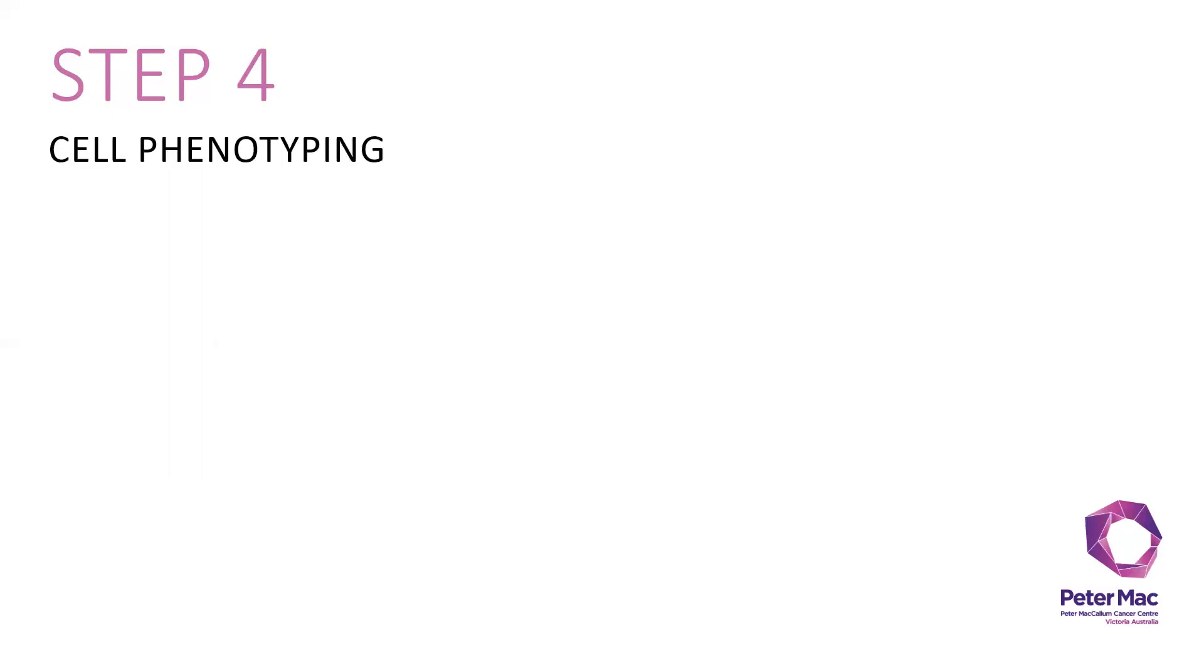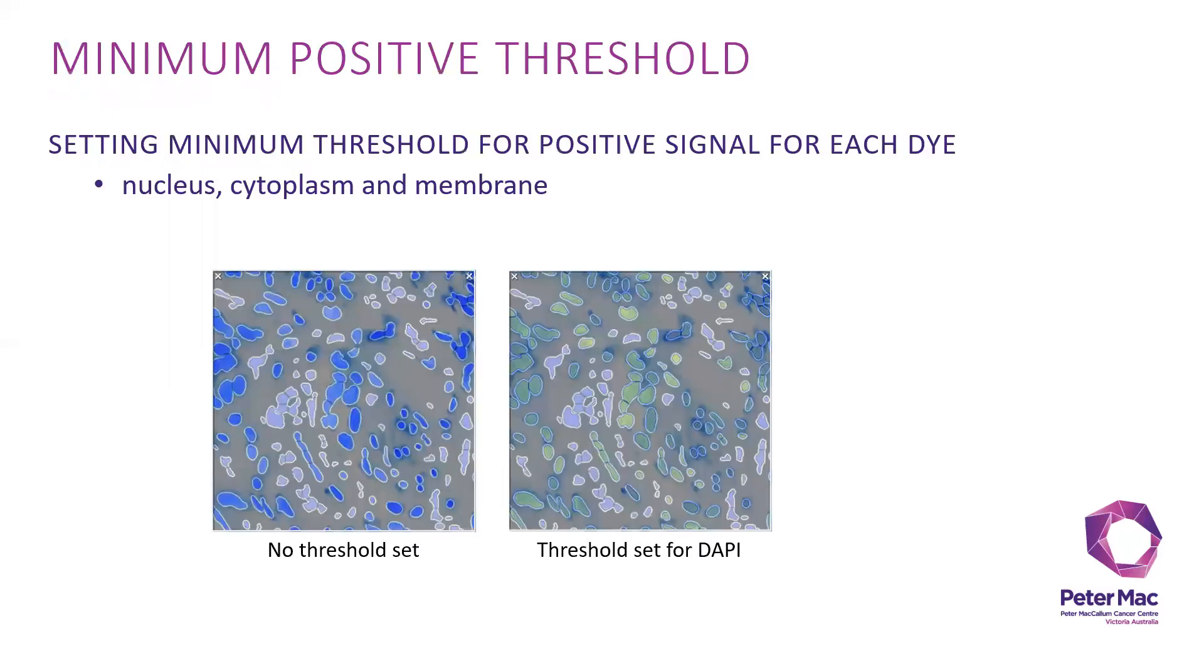After you're happy with the cell segmentation, you can move on to cell phenotyping. First, you have to set minimum threshold for positive signals for each dye, depending on each marker.